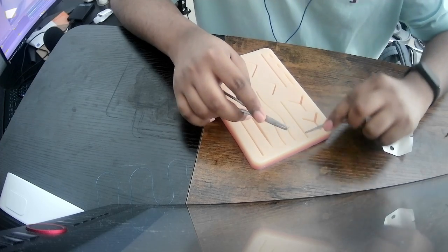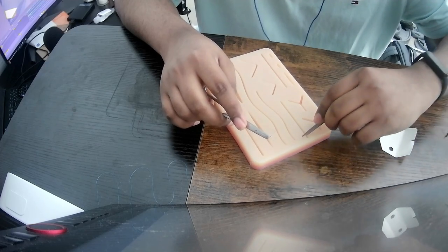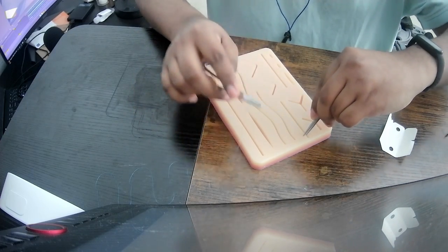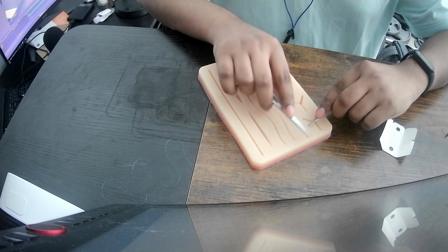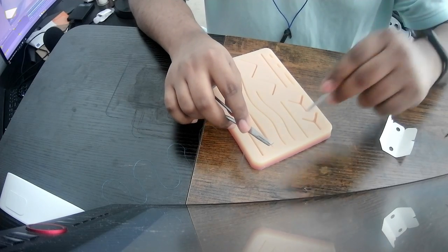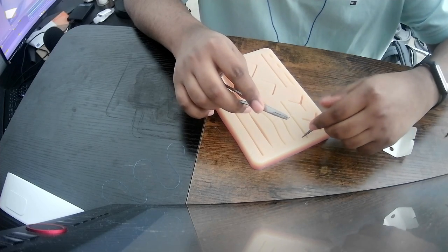So what do I do again? Okay, I use my Addison's forceps to gently manipulate the side I'll be working on first. So I'll be entering the right side, exiting in the open space, and then entering the left side of the skin. And I'll be using this to both manipulate the skin and also reload the needle once I'm on the other end. So let's just try it.